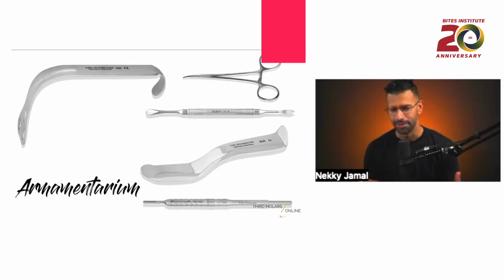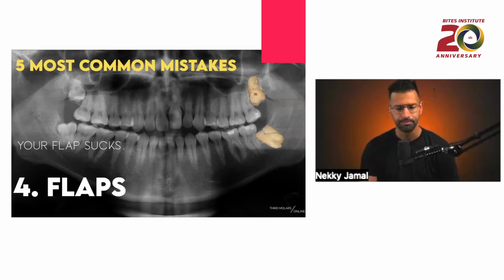There's a lot out there that's in my kit. A lot of people like the Molt 9 periosteal elevator. I'm not a big fan of it, but I like the Minnesota retractor. I use a drop leg scalpel handle and a Weider retractor or a Sweetheart retractor to retract the tongue back, and that really helps me get great vision.